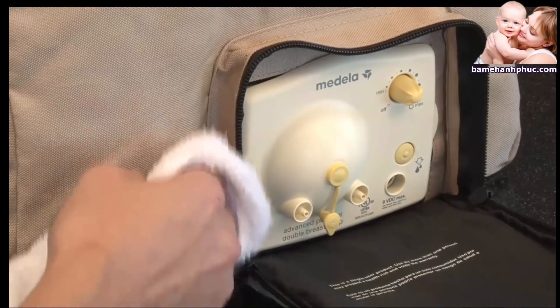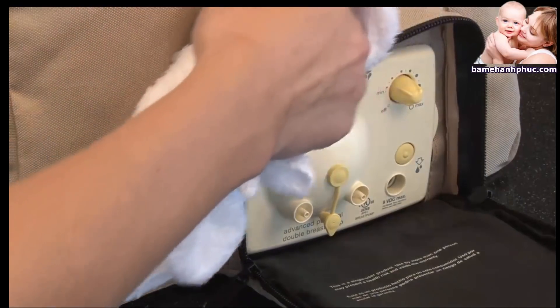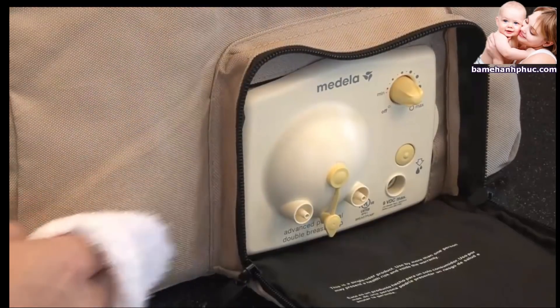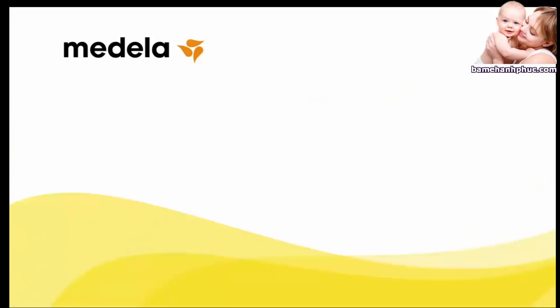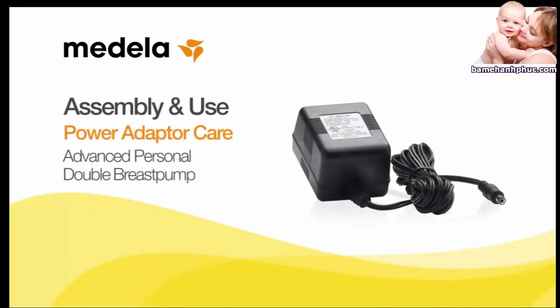Use a damp — not wet — cloth to wipe the bag when necessary. Do not immerse the motor unit or any part of the pump bag in water. It is important that you use only the power adapter that came with your pump. For safe maintenance, proper storage, and handling of the power adapter and cord, follow these instructions.